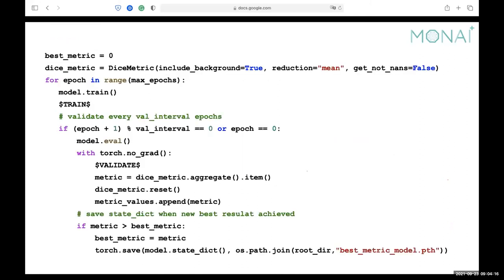For the whole training process, we start by initializing the best metric as zero, then initialize the Dice metric from MONAI. For each epoch, we do the training, and for every validation interval we do the validation. We record the best checkpoint — whenever we achieve a higher score than the previous best metric, we save the new model.